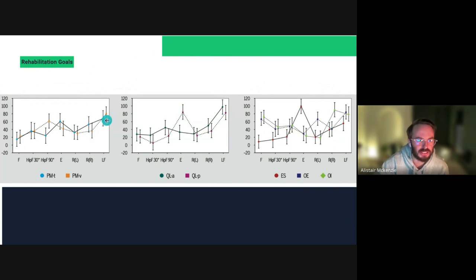Haven't got onto rotation, that's for part 2, but lateral flexion, again, you can see even higher than extension. Both aspects of the psoas major control that. QL, again, we can look at how it changes with that extension, with a massive difference in the posterior compared to the anterior aspects. And then in the lateral flexion, again, maximal contraction.